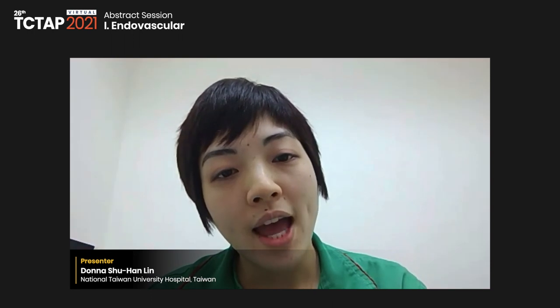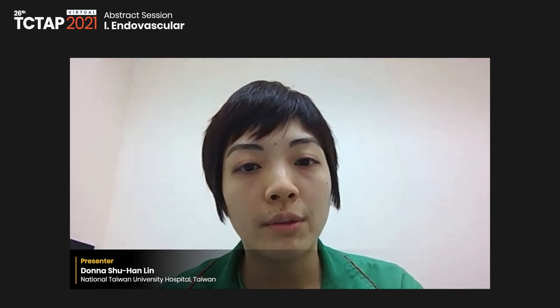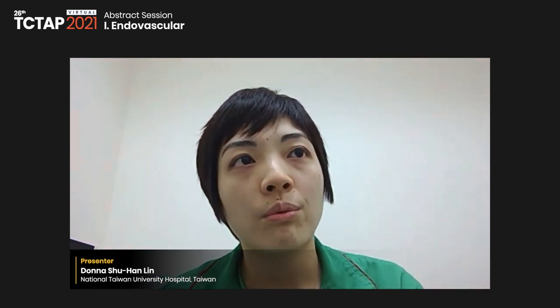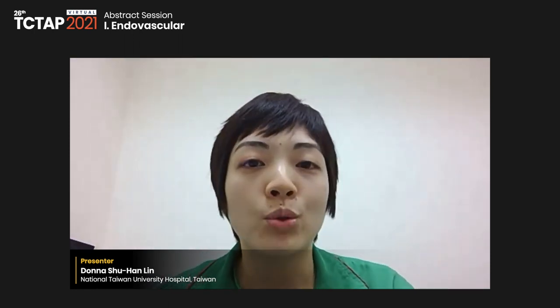Right. So at this moment, we do not have any data that directly compared, like you said, head to head, Supera and DCB with a DES. We started this study because of the prior RAPID study that compared Supera with DCB to Supera alone. And what we were thinking of was, for one thing, the atherectomy devices were not all reimbursed in Taiwan, and it would be preferable if there was another way to deal with calcification in our patients. So at this time, what we were thinking of was how to deal with the recoil and the dissections after balloon angioplasty. So we compared balloon angioplasty with balloon plus a stent.